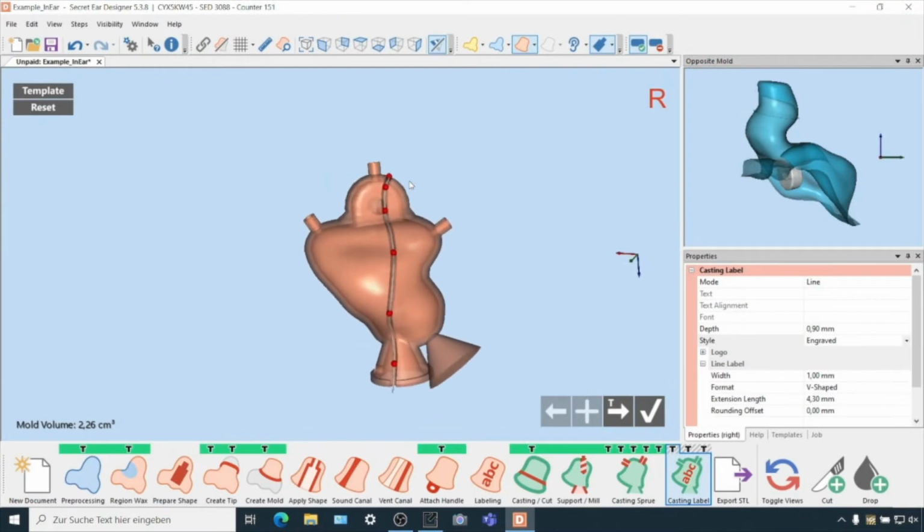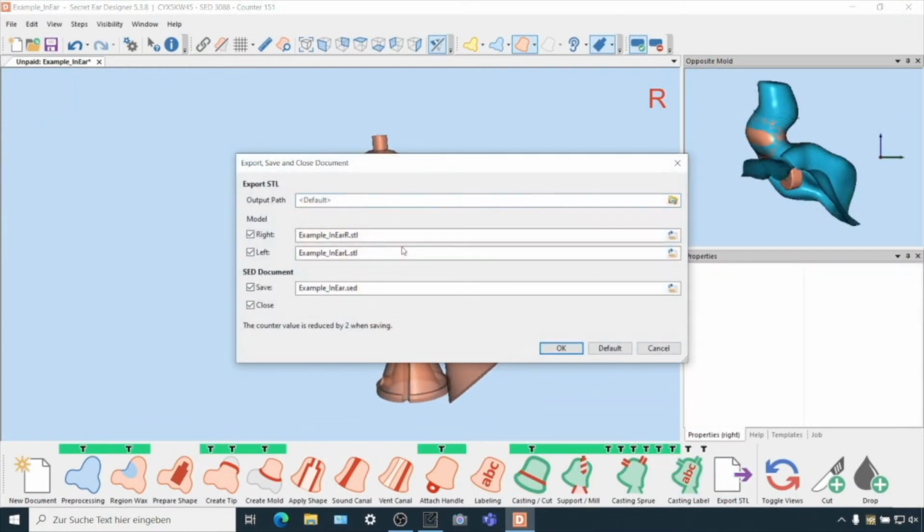Okay, so the last point is only to export the STL file. In this case, it's not needed. And now we can switch to save it, for sure. Okay, save it at first. And after that, we can go to the Composer software to prepare a print job. It is also absolutely easy.